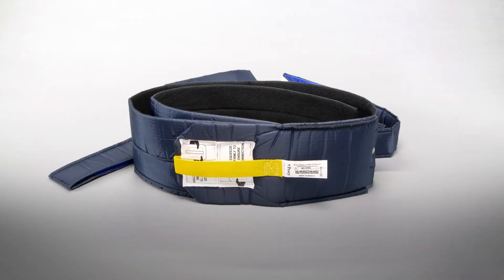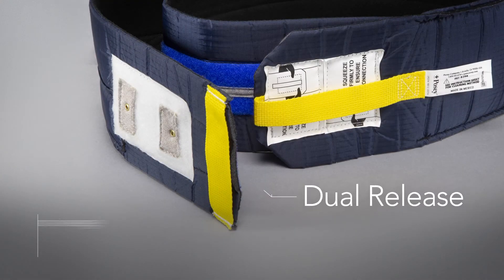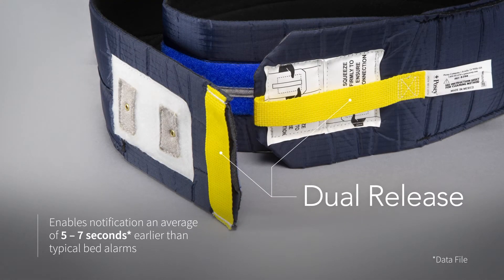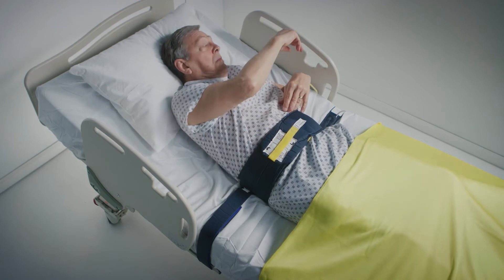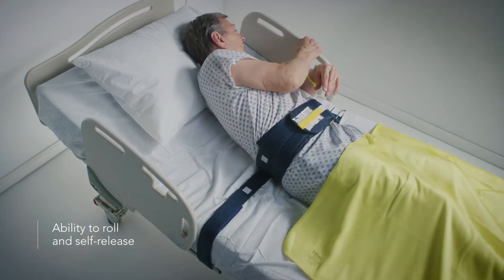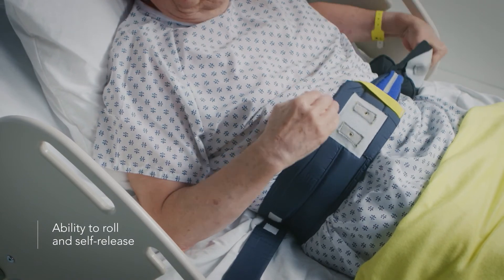The Head Start Notification Bed Sensor provides an early indication of a possible unassisted patient bed exit and offers a gentle reminder to the patient to ask for assistance when ambulating. The dual release feature enables notification an average of five to seven seconds faster than commonly used sensor pads. While using the Head Start Bed Sensor, patients can roll and even self-release, serving as a restraint alternative device.